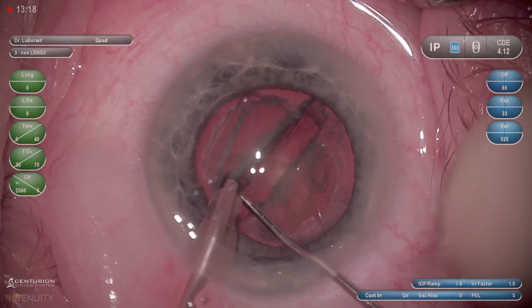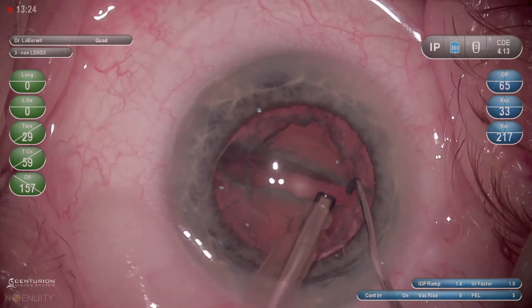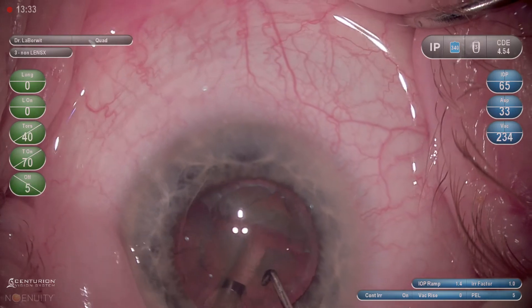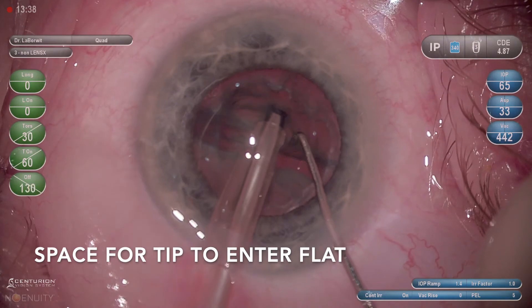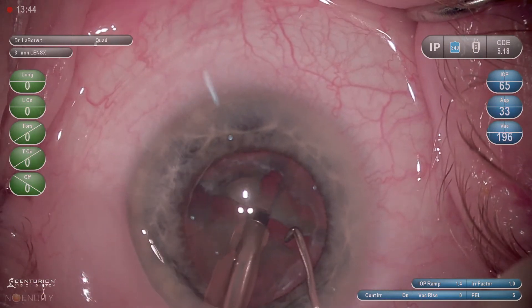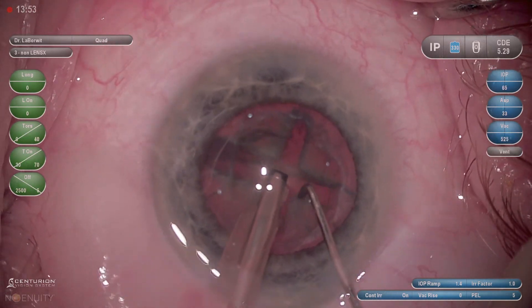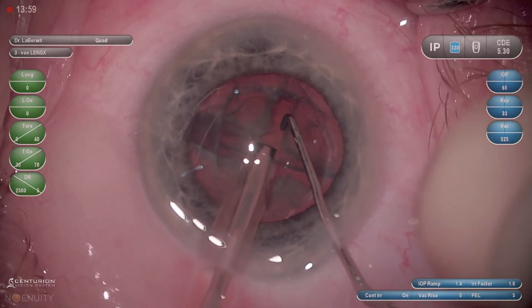Given the density of this lens, I decided to use a divide-and-conquer technique, so I rotated 90 degrees. It's tempting to go into the distal half, but I'm sculpting proximally, knowing I really want to only crack the distal half. By creating this space, my instrument can fit in better and I can enter that distal half with a flat tip and sculpt in a safe manner, using many of the principles from the steps for the initial groove. Then I place the instruments deep into the groove and am able to crack.